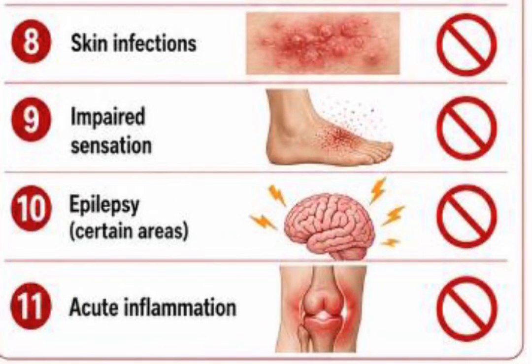Don't use it for patients with skin infection, because it could increase inflammation and cause the skin infection to spread more. So don't use it for patients with impaired sensation. Before you even use a Faradic current, the patient has to be innervated. The nerve has to be working. You have to do a sensory test and a motor test to make sure that the patient is feeling. So you don't use it for patients that have sensory impairment.